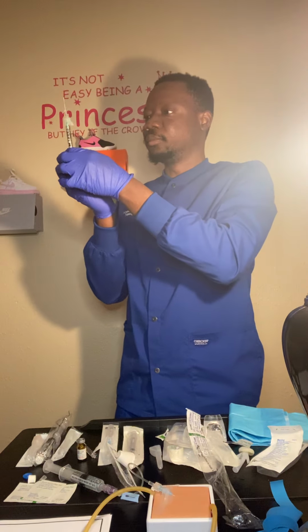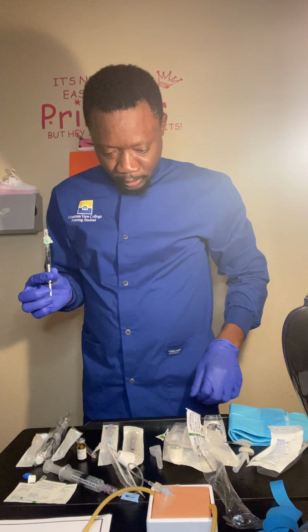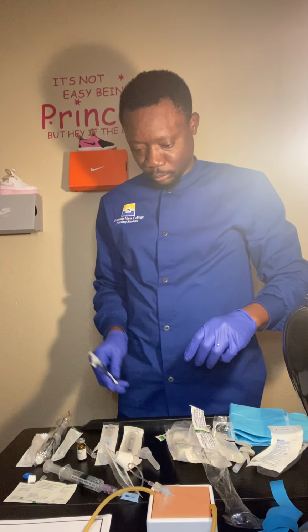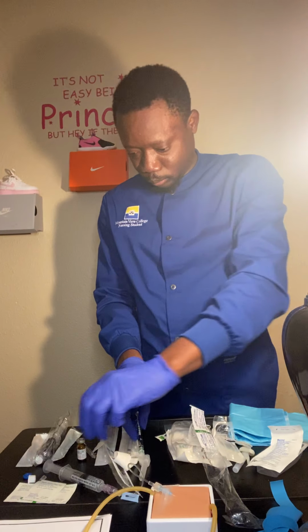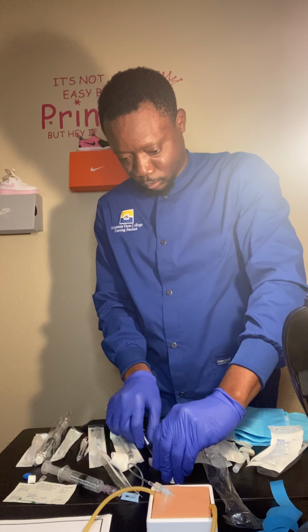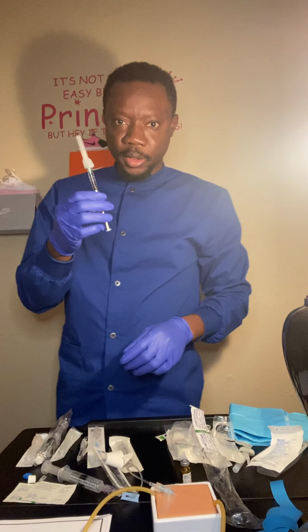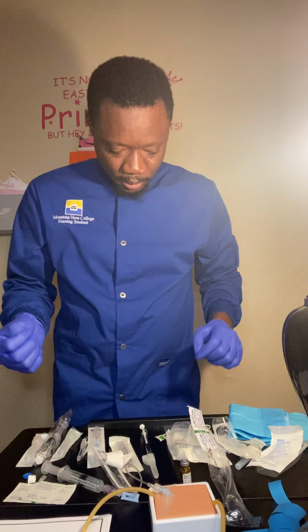Okay. Make sure there's no air bubble. No. Okay, got my medication 0.5 ml. And then it's time for administration.